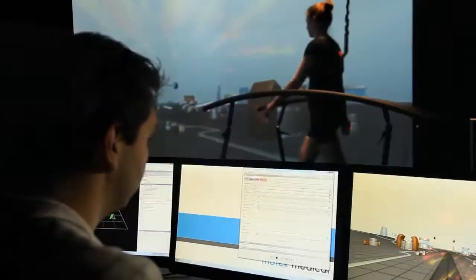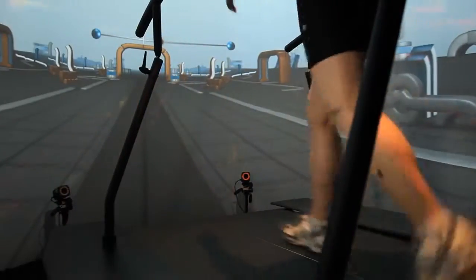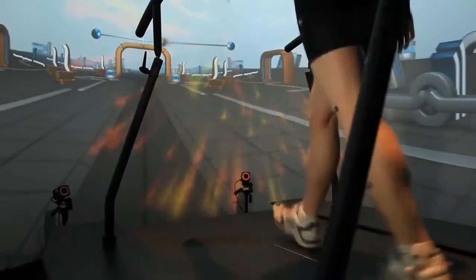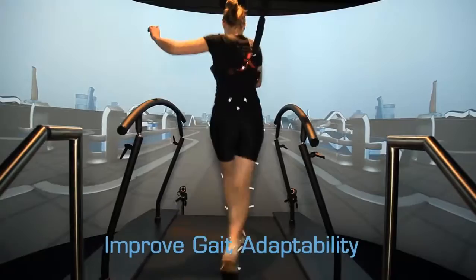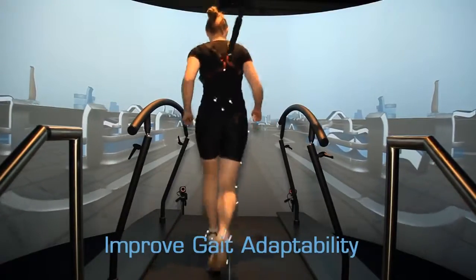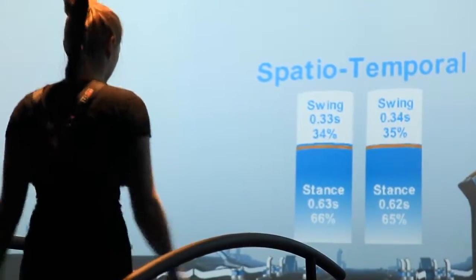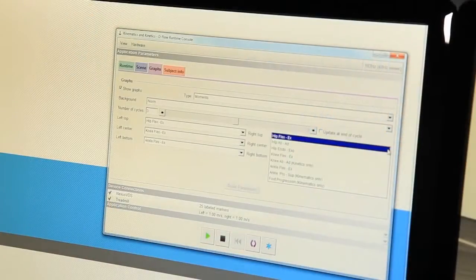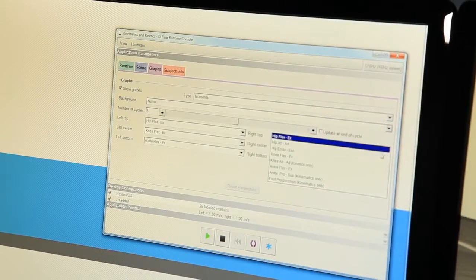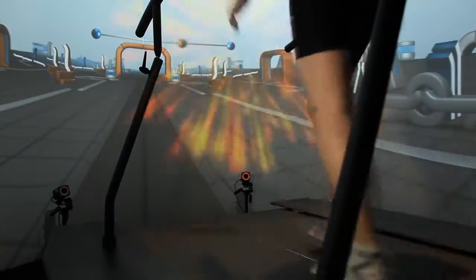GRAIL goes beyond gait assessment. For the first time, all gait data can also be used for training purposes — to improve gait adaptability and dynamic stability to prevent falls when sudden adaptations are required. Use any gait parameter to drive gait retraining applications.